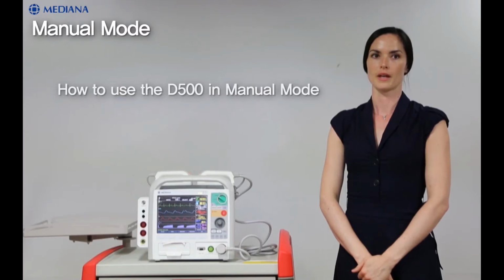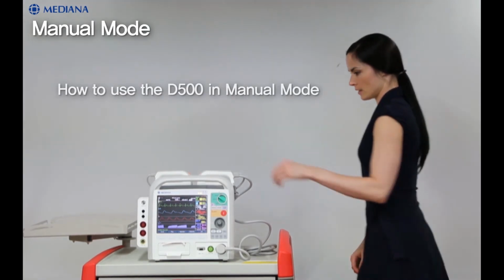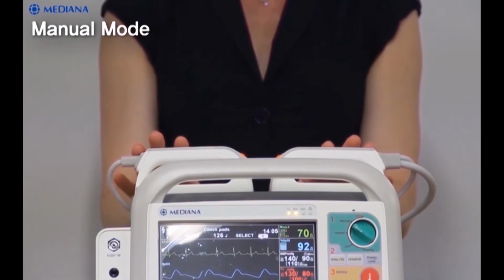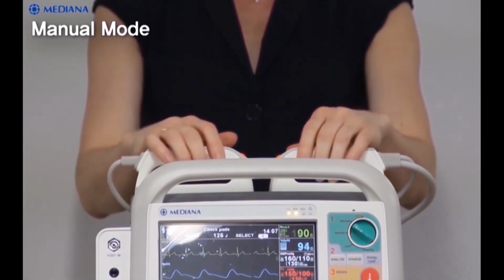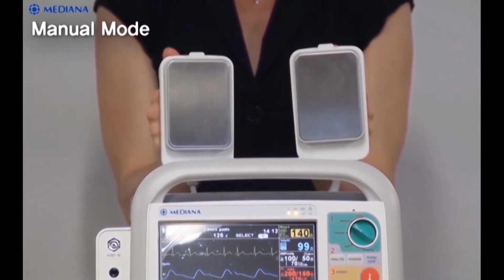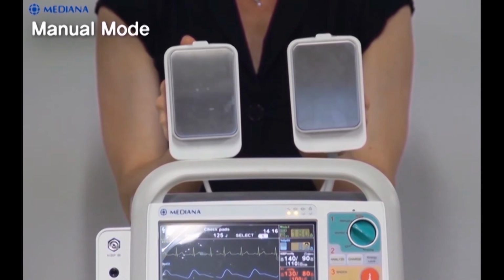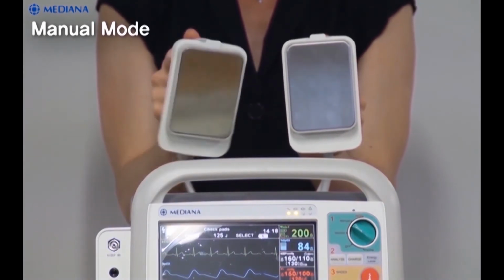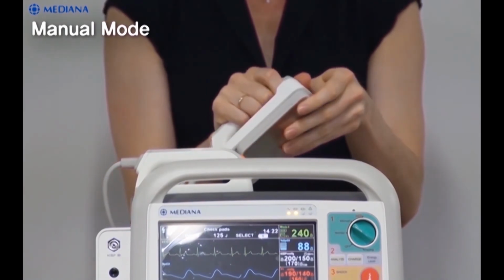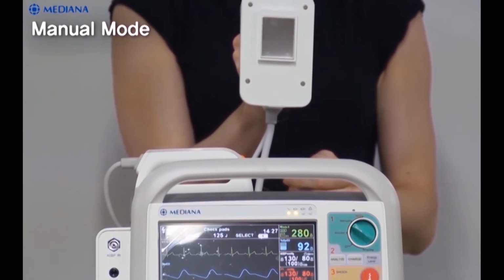Manual mode. Let's see how to use the D500 in manual mode. You can see the external paddles are placed on top of the D500. Remove the paddles from the paddle tray by pulling the paddles straight up and out of the paddle tray. D500 external paddles come with pediatric paddles included. If you want to use the pediatric paddles, depress the latch at the front of the external paddles while pulling forward on the adult paddle plate.